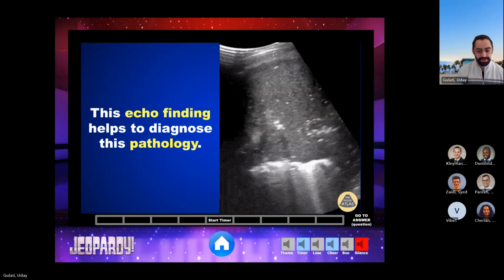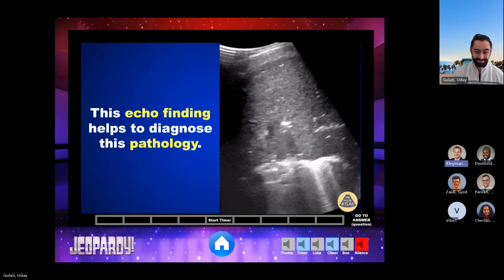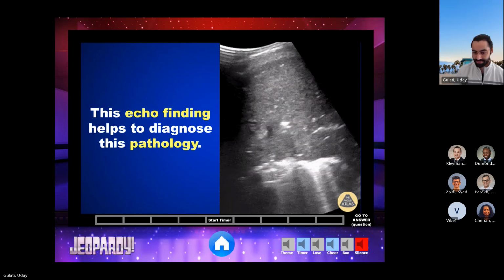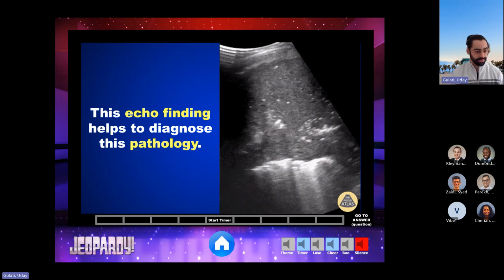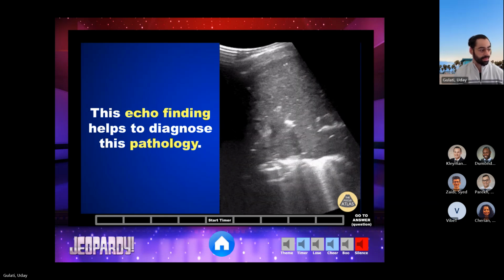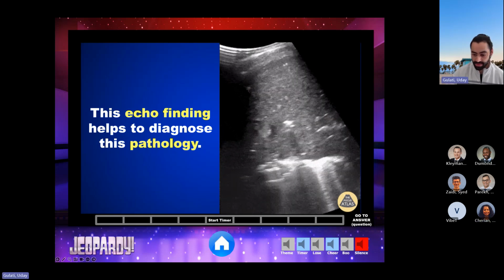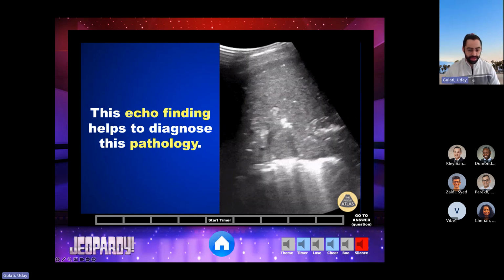Close. Not wrong, actually. He's not wrong. There's a specific name for it. Feba, what did you want to say? It was going to be the same, hepatization and then consolidative. So you're right, it is a pneumonia. Do you guys see any other findings that could help support your diagnosis?